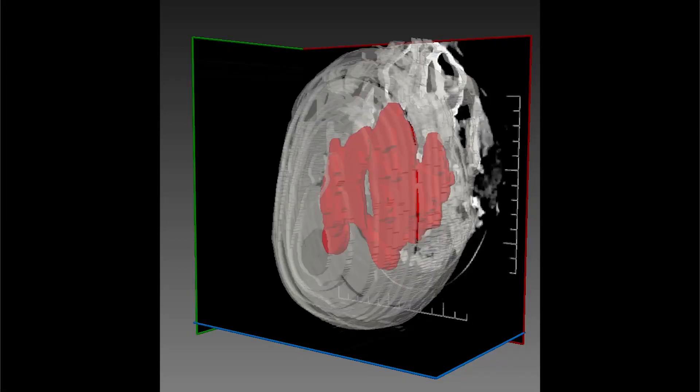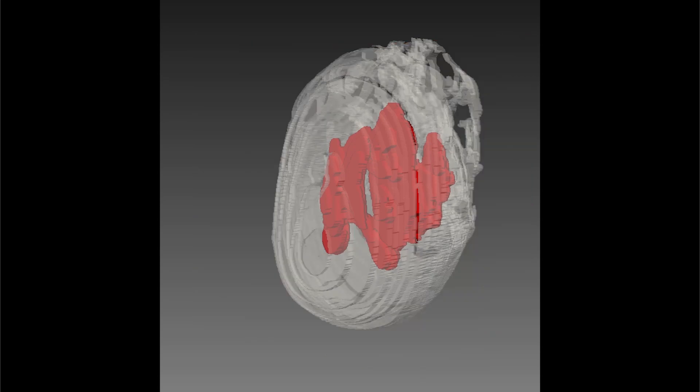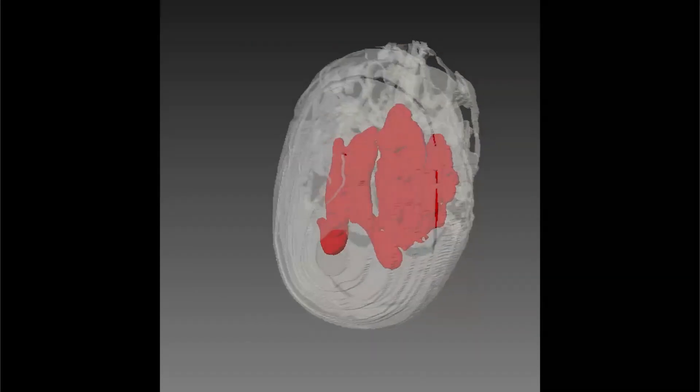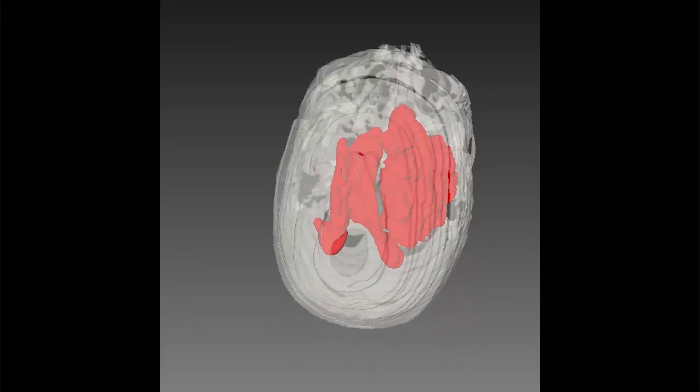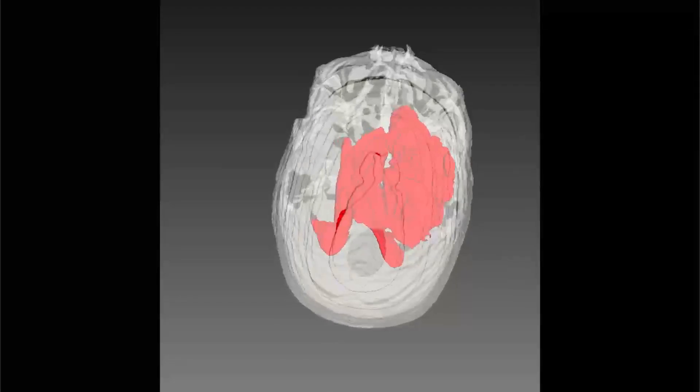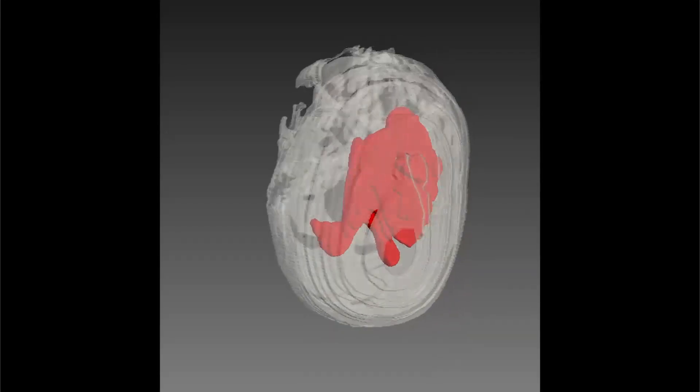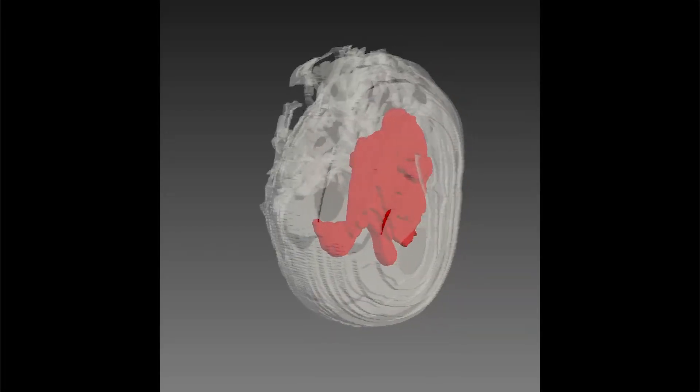Some hemorrhages are also accompanied by cerebral edema, an excess accumulation of fluid in the intracellular or extracellular spaces of the brain.